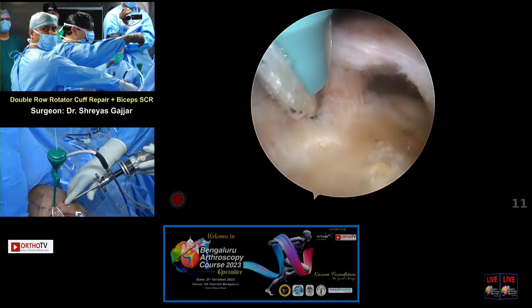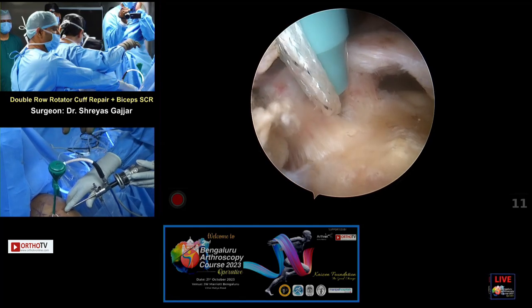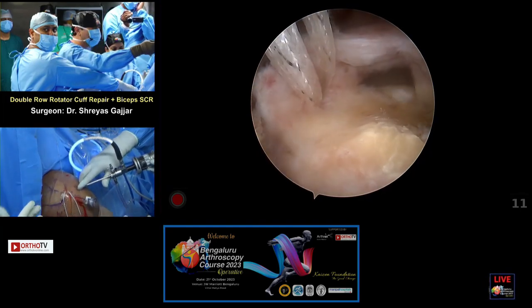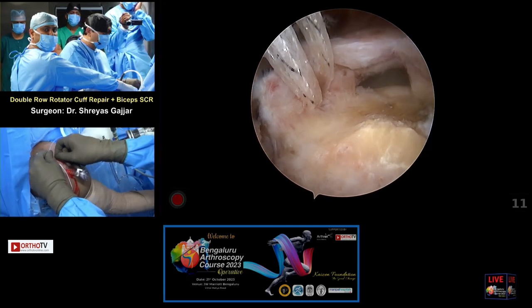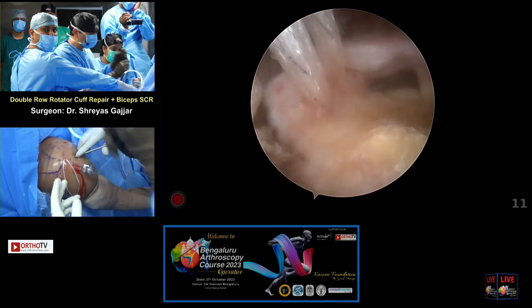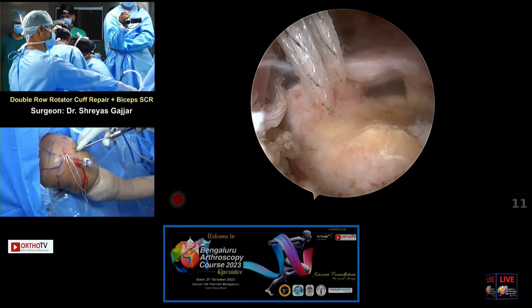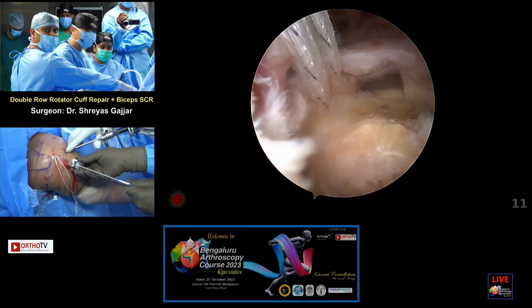So the eyelet suture, I will pass it through the cuff. The eyelet suture, I would retain if I have a retracted cuff and I want to tie medial, anterior to posterior sutures. But here it's not a retracted cuff, so I remove the eyelet suture. And now I'll retrieve the tape through the cannula. Tape retriever, please. Tape retriever. Thank you.